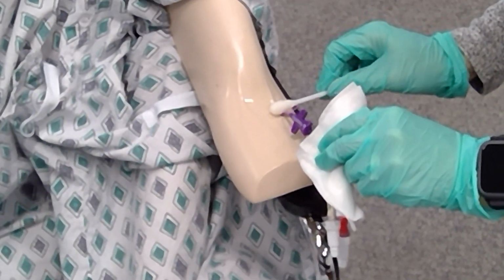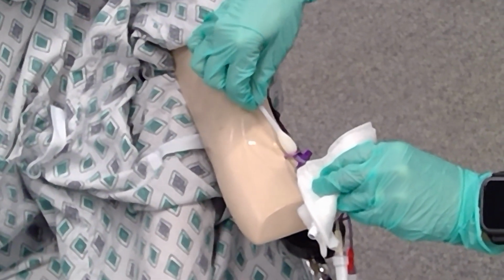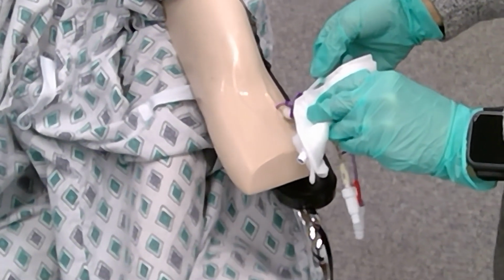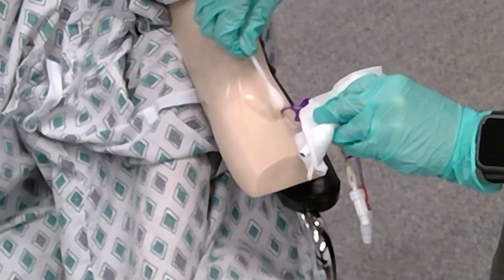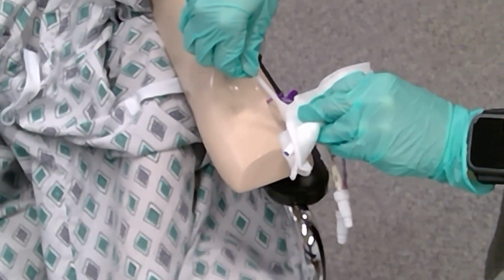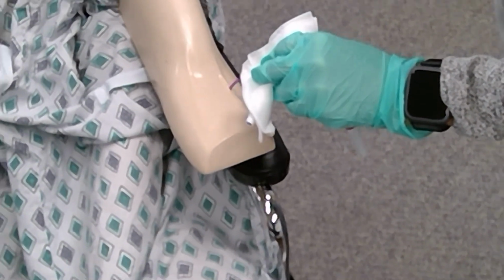So I'm going up the line with one pass, and then I twist the alcohol swab and go to the side. Twist the alcohol swab to the other side. Twist the alcohol swab and go to the last side. Everything that's going to be underneath this dressing needs to be cleaned. And I'm going to toss that in the trash.